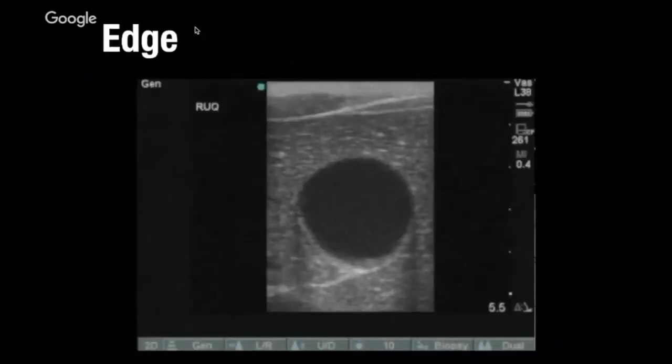And then edge artifact we described as the idea of a perfect tangent, right? If you don't actually have a reflective surface, you can't reflect. And it's something we practically see with a liquid substance within something more solid. So when the beam hits just that edge, it can reflect everywhere except back to the probe face, so you just get dropout signal from that one spot.